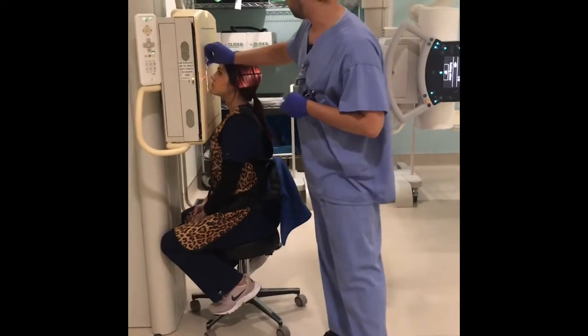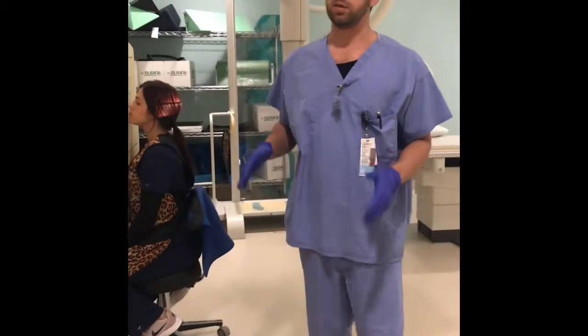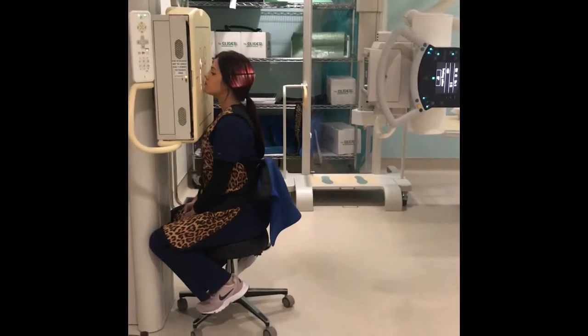So I'm going to hit that with the left marker right there. And again, I'm going to do 75 at 10, maybe 12 for this digital. All right, so now again, hold your breath and try not to move. X-ray, all right.